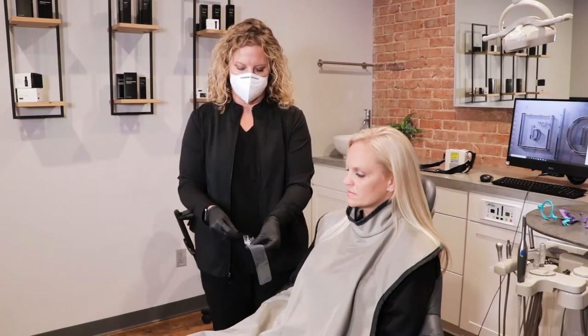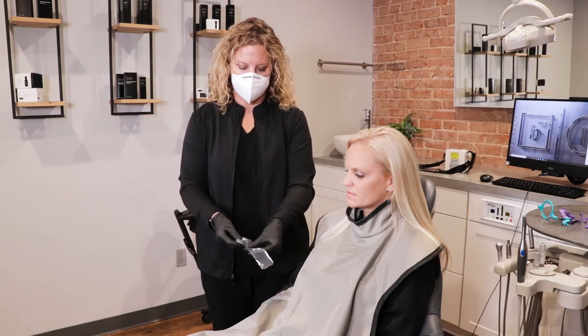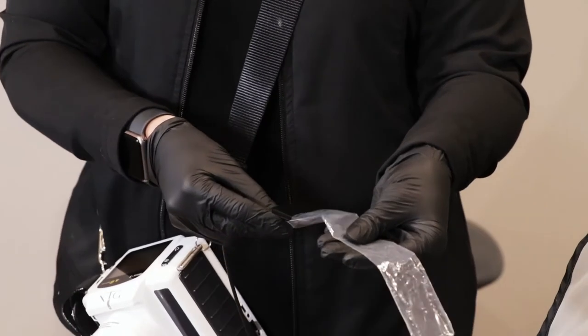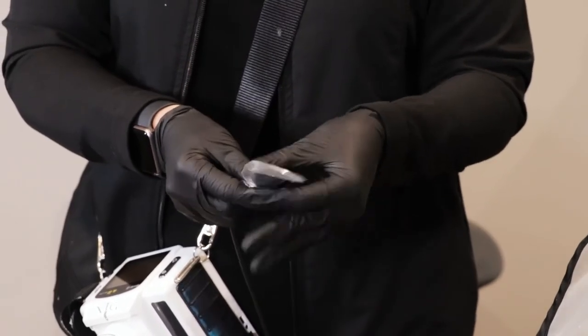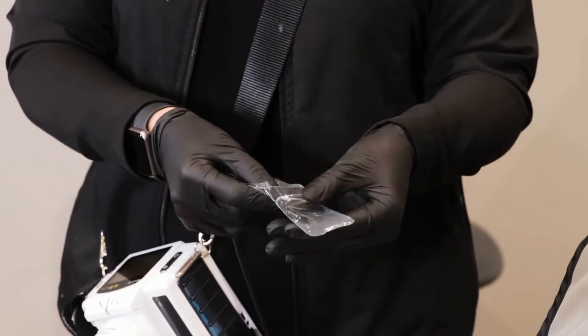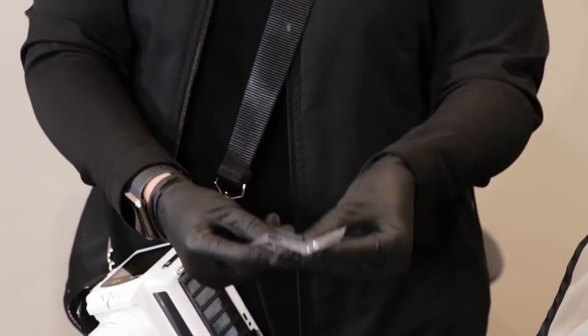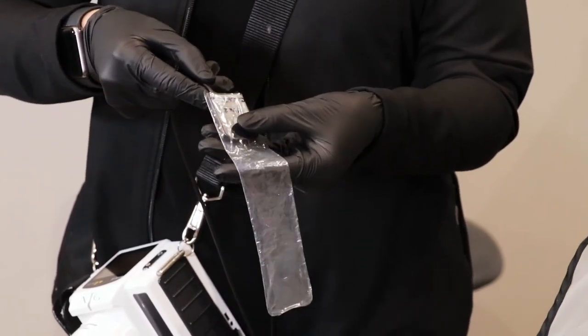Barrier placement. To prevent cross-contamination of the sensor between patients, you always want to use a barrier or sheath on the sensor before putting it into a patient's mouth. Using the recommended barrier for your sensor, slide the sensor into the barrier, pushing it all the way to the end. Make sure that the cable is covered as well. When removing the barrier from the sensor, make sure you avoid pulling on the cord.